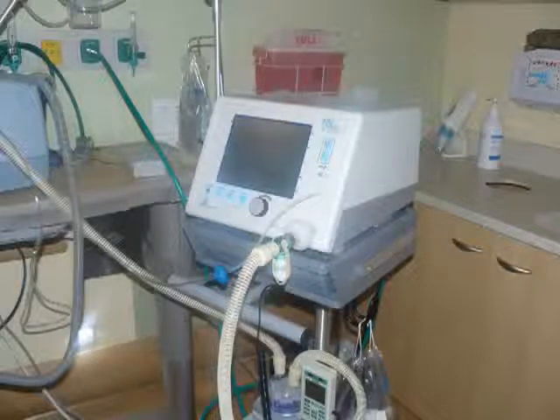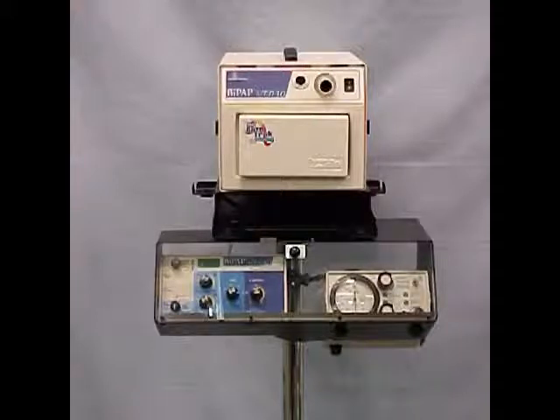Now, before we had the wonderful Vision BIPAP, the predecessor would be the STD-20 and then later the STD-30. The picture you're looking at now is of the STD-30. These machines, although not as easy to use as the Vision, are still very commonly used. My preference would be a Vision BIPAP, and I would probably pick this one second.